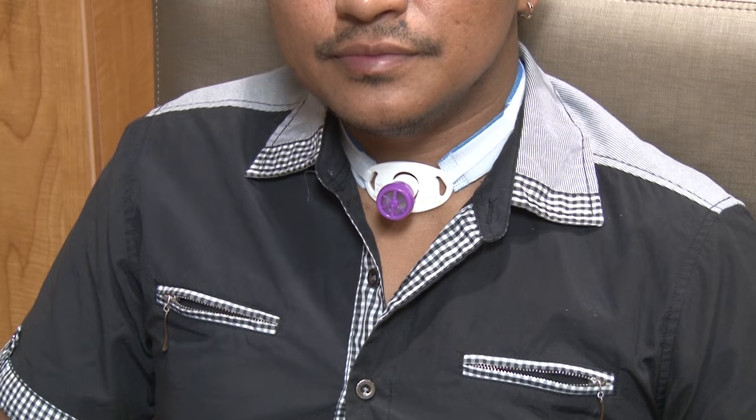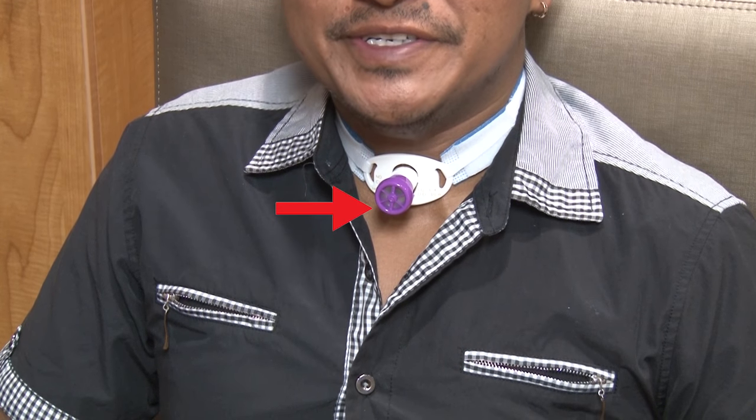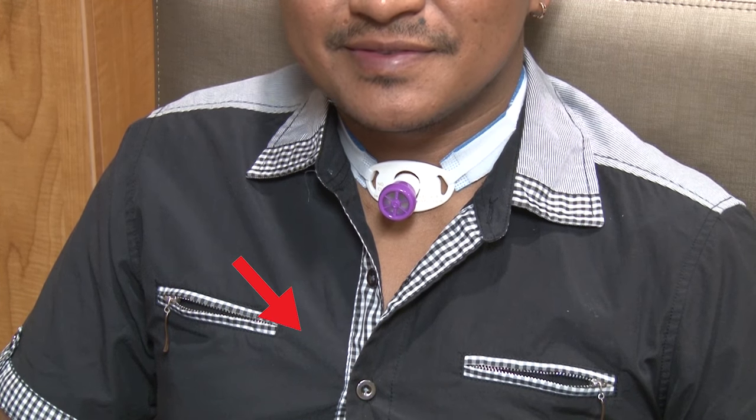The one-way valve works by letting air come in through the valve to the tracheostomy tube and down to your lungs when you breathe in. When you breathe out or voice, the valve closes forward and air goes up to your mouth to talk.